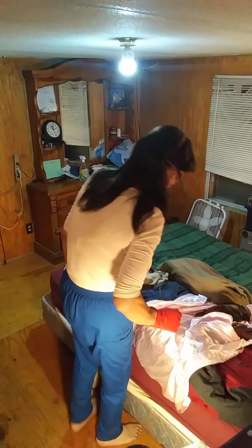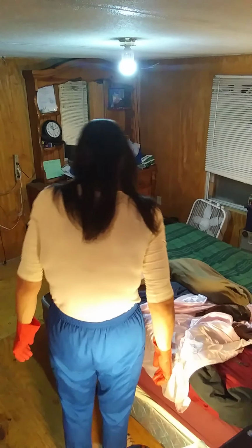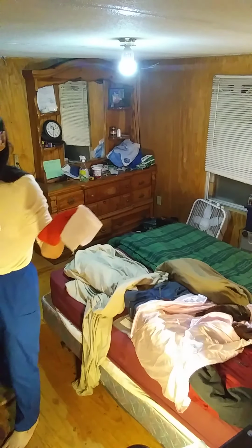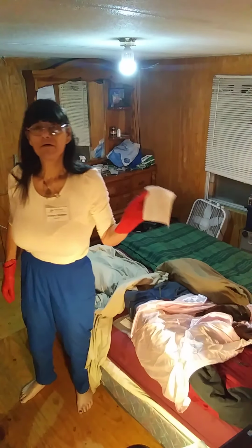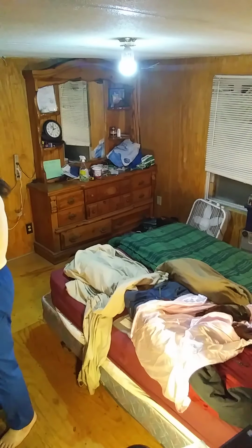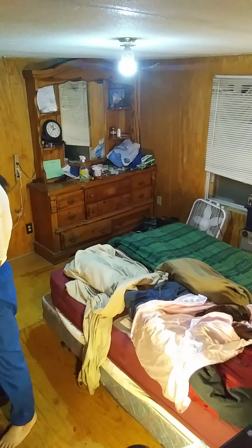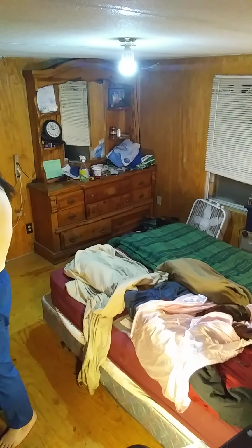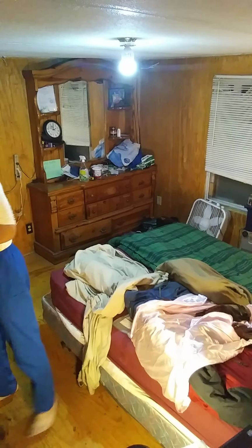Alright, so I'm going to begin to wash Miss Cheswick. I'm going to take one of my washcloths. I'm going to wet it. I'm going to wring out all the extra water. Take some soap.